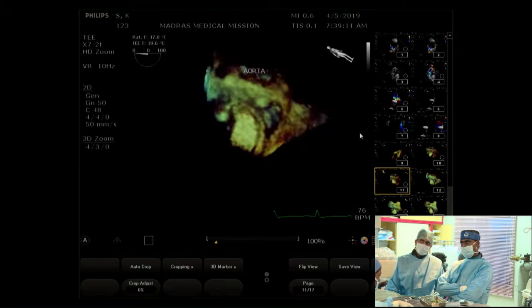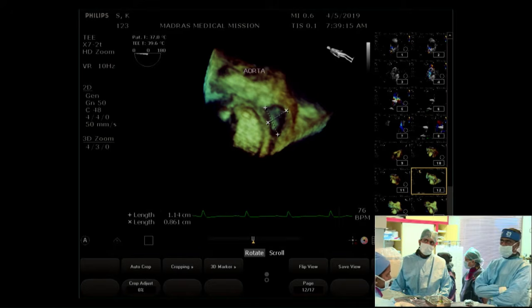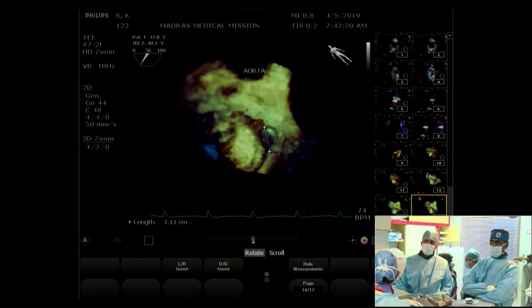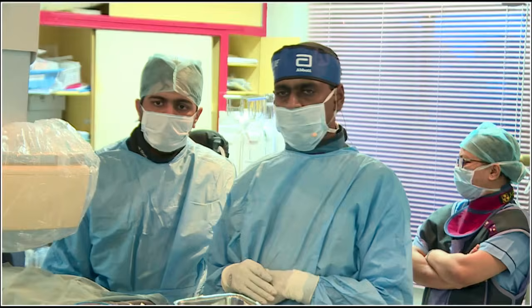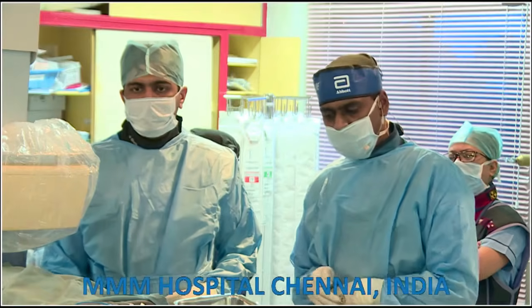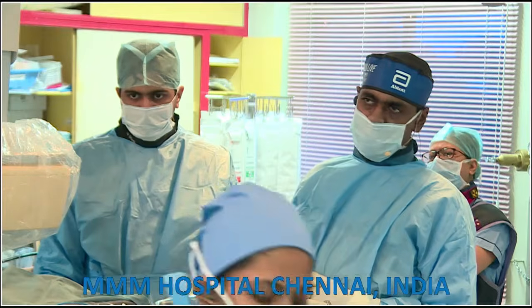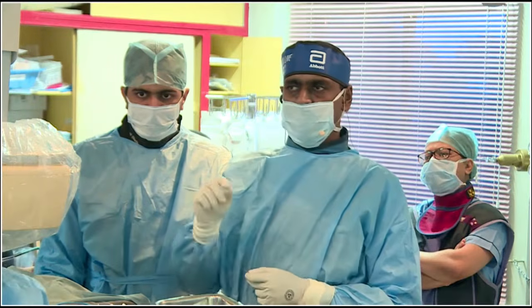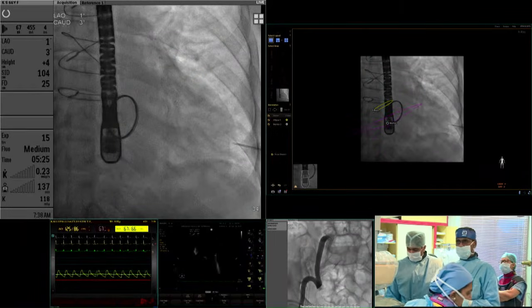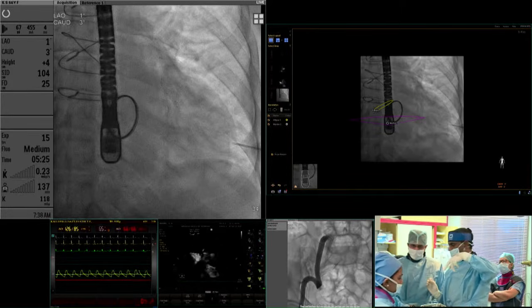This is the same image. And here on a 3D measurement, it measures a maximum of around 11 millimeter. Here it's again consistently measuring around 11 millimeter. Basically there was not much coronary myocardial ischemia because the LAD flows are reasonably preserved. We did not do a coronary angiogram today because an angiogram was done just within 1 month ago. So we are now going to start demonstrating how we do the apical paravalvular leak puncture.